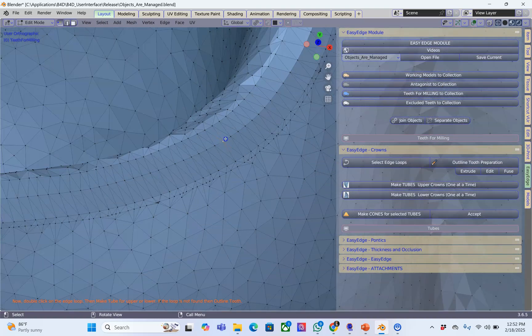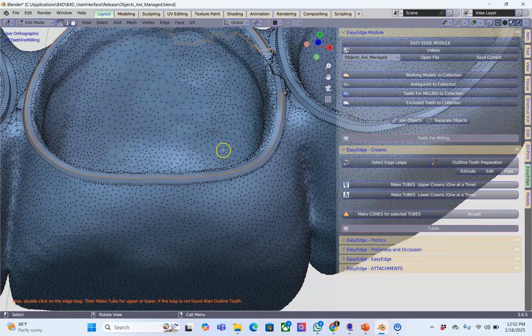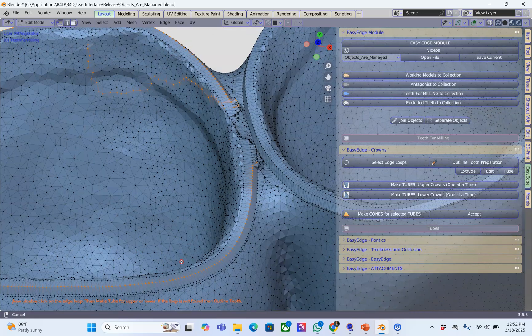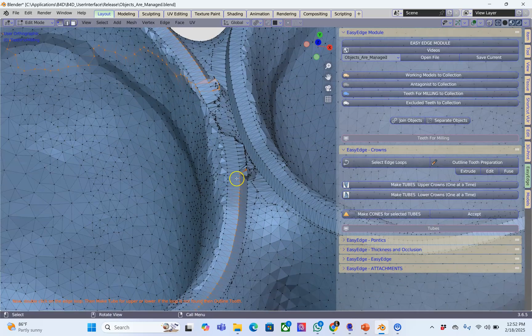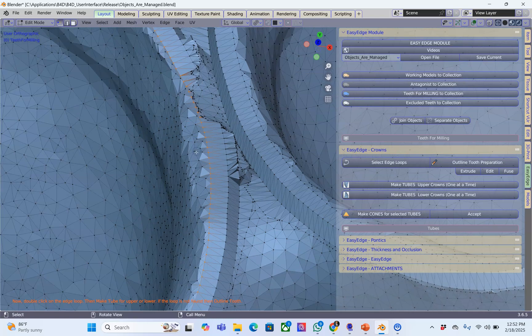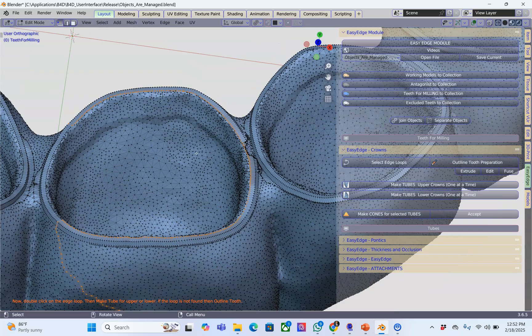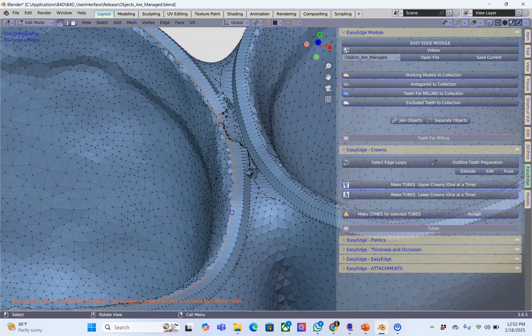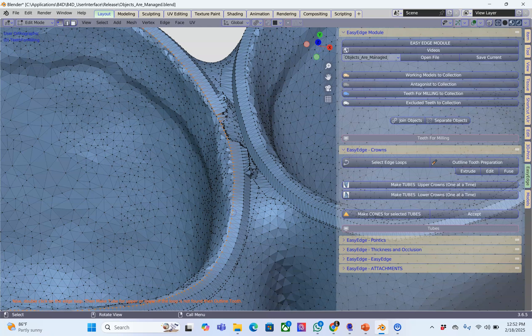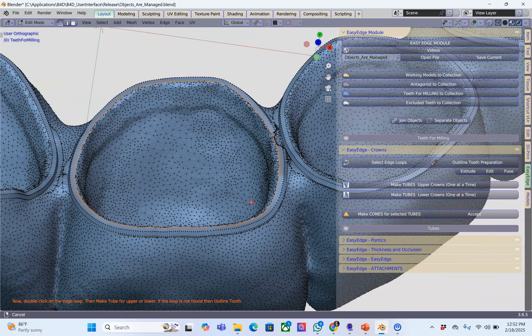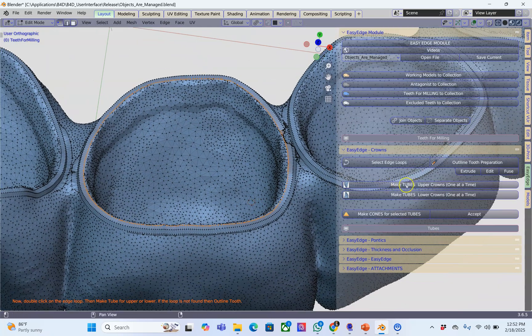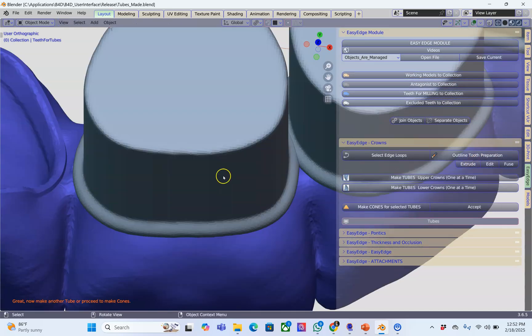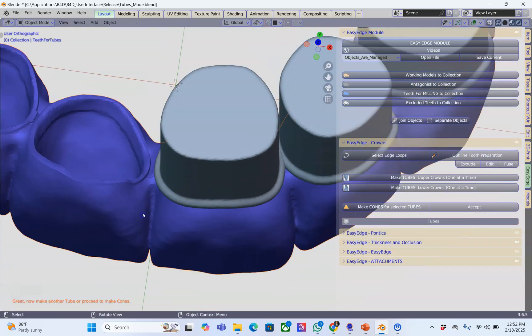We're going to select the edge again and here it didn't select a whole lot. Let's try this one. This one also didn't work. Let's try one more time and this time it worked. Sometimes you have to just try and try again. If it doesn't select then you're going to have to use the outline tooth preparation.